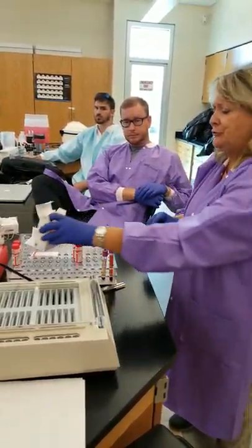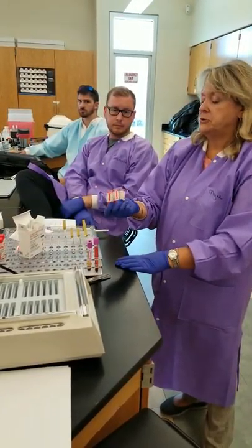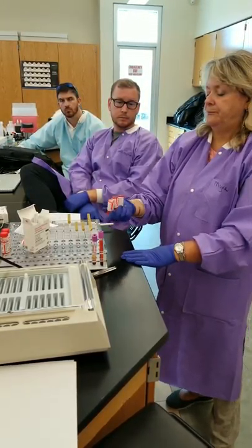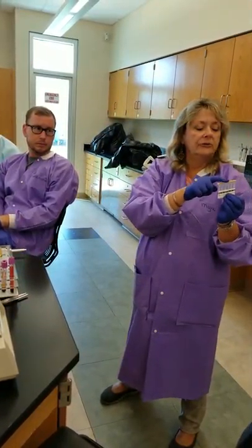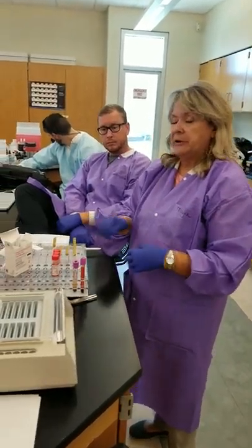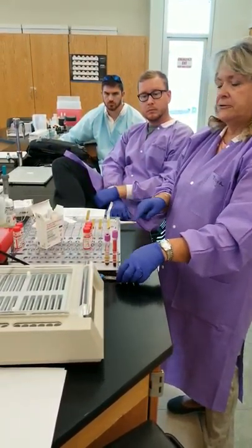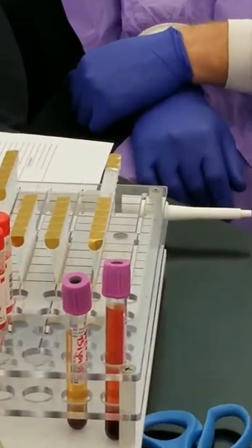So what I typically do first, because it requires incubation, is I'm going to do my screen first. Okay, so I'm going to make sure that my cells are resuspended from the bottom. Now, there are 6 wells, and we have 3 cells. So all I need are 3 wells. So these other ones can just ride along, and then I can use them for somebody else later on. But I don't want to open them up and leave them exposed to the air, because that's going to dry out the gel and make them worthless to use. So what I'm going to do is pull the first 3 wells open and cut off the foil so that I have my three wells accessible.